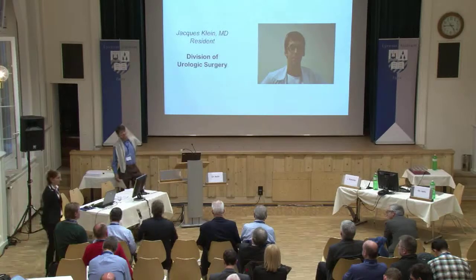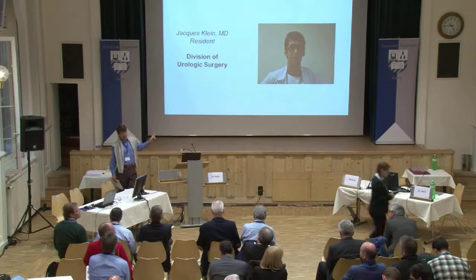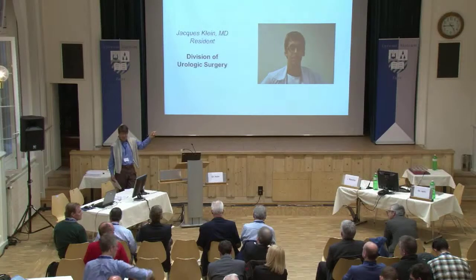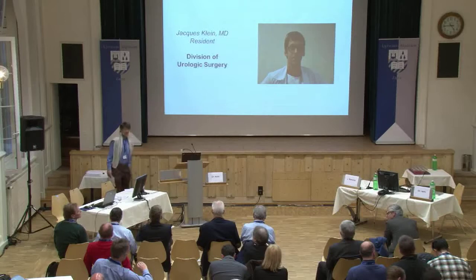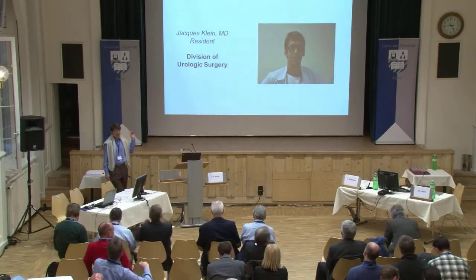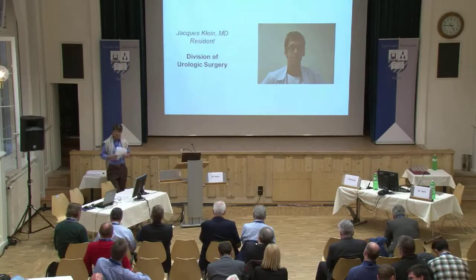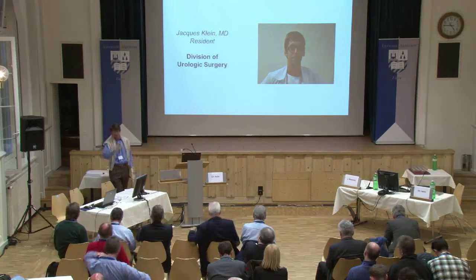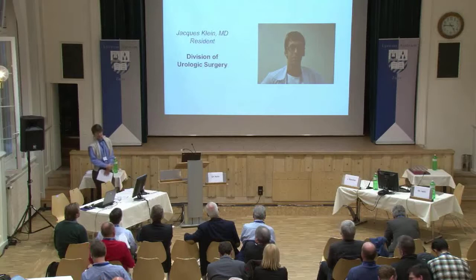Now, to answer the second question, I only showed you the first 2 stages of our study. And of course, the third step is looking at pathology, and whether those changes, those risks that we took according to capsular penetration or not, were well taken. And regarding the sensitivity with prostatitis, of course, this should be questioned. But we had one patient who had whole metabolic activity of his prostate, and that was clearly a prostatitis. But when you get a focus, it could be a prostatitis focus, and nevertheless we have to think about that. I agree with you.